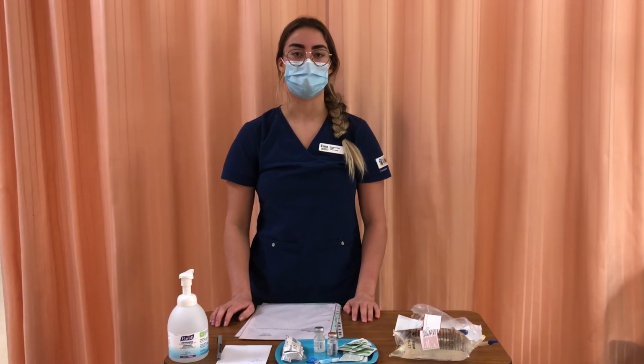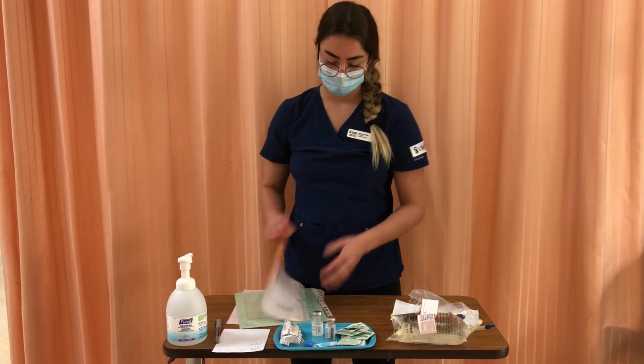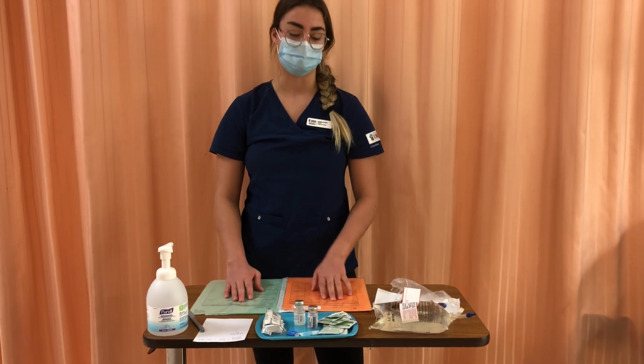My name is Kat, and I'm going to be demonstrating how to administer an IV medication via mini bag. So, I've already compared my physician's order to my MAR. They've been transcribed correctly, and there's 2 signatures on each.